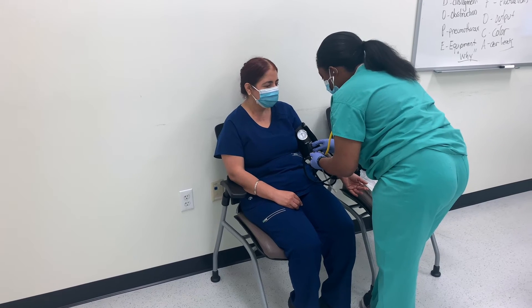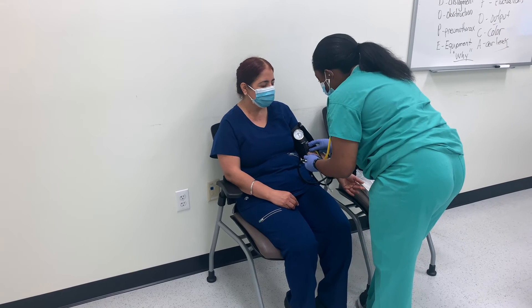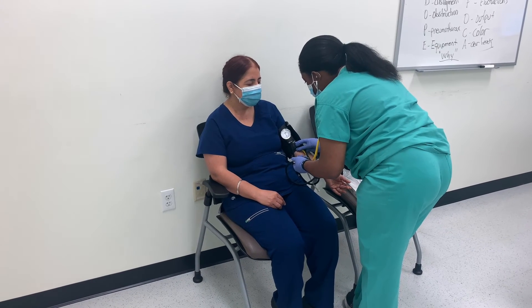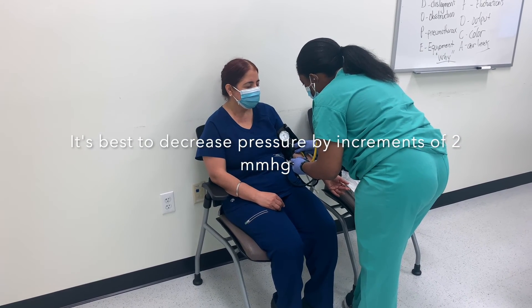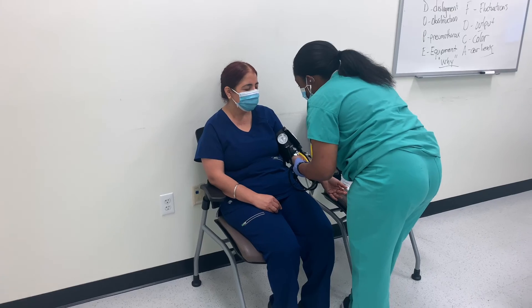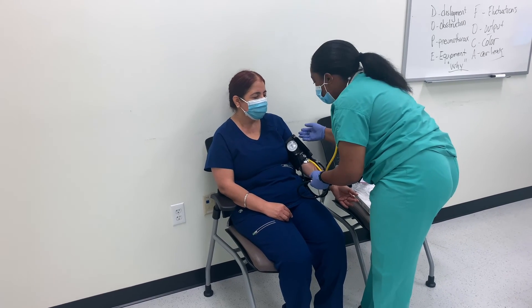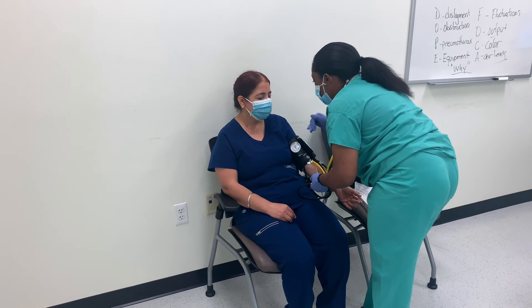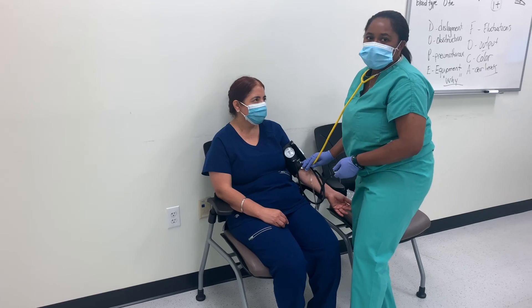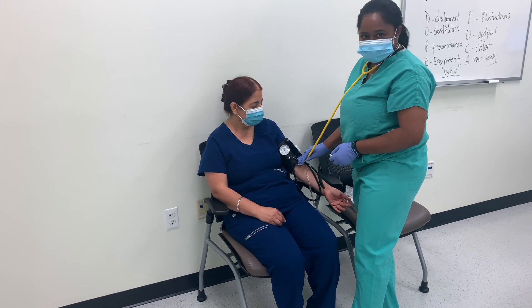I pump to 130 and slowly release the pressure. I start hearing the sound back at around 110, so 110 will be my systolic pressure. I completely stop hearing her pulse at around 75, so her blood pressure will be 110 over 75. That would be the number that you will be recording. Thank you, guys.